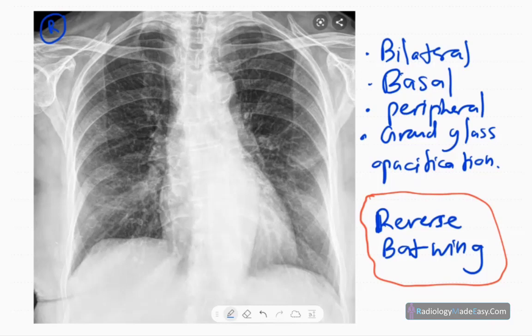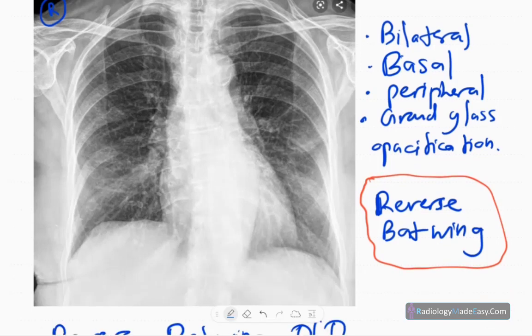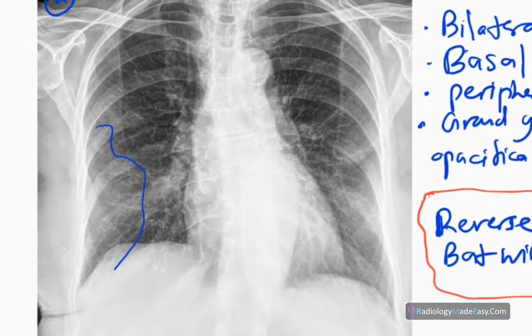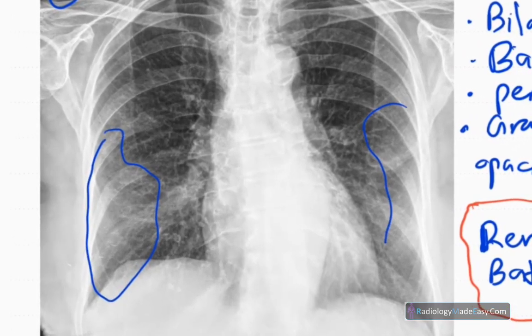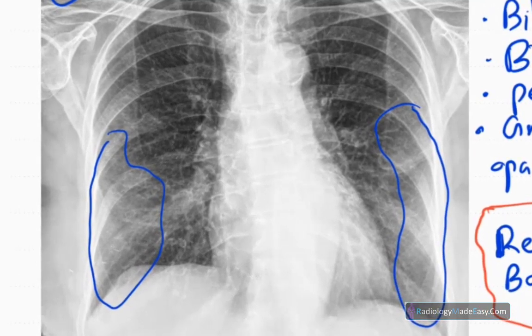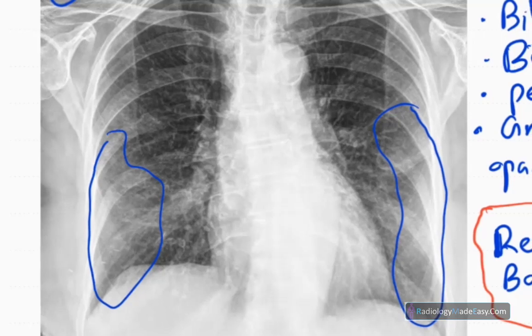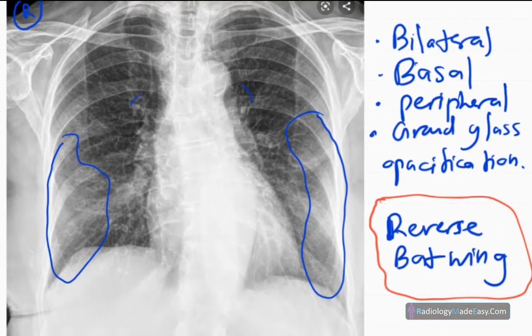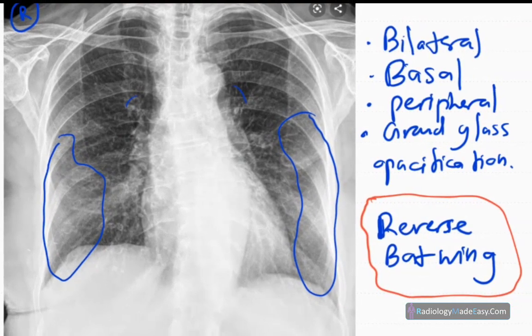On chest X-ray, the early stages may appear normal, but you can see peripheral and bi-basal ground glass opacifications — essentially airspace opacifications. When these opacifications occur peripherally, we call this the reverse bat-wing appearance, as opposed to the perihilar bat-wing pattern.